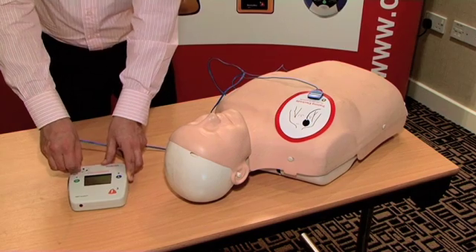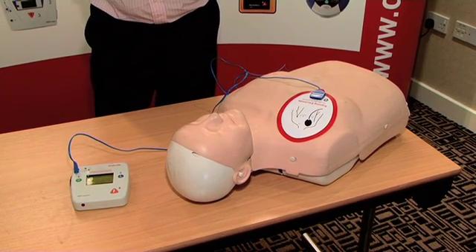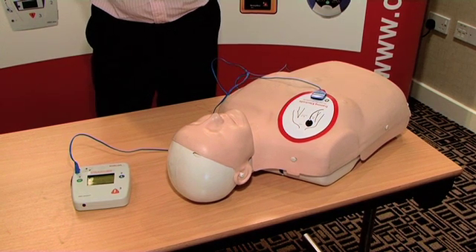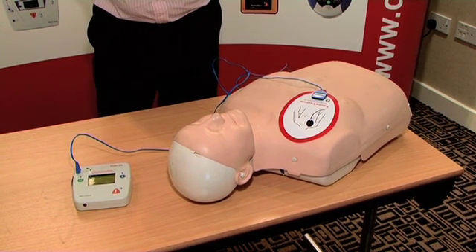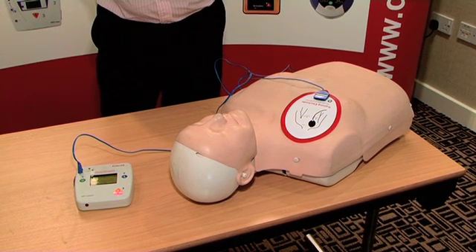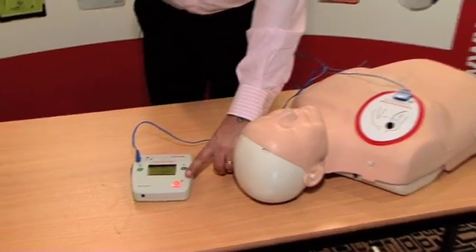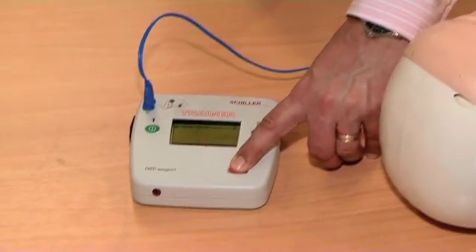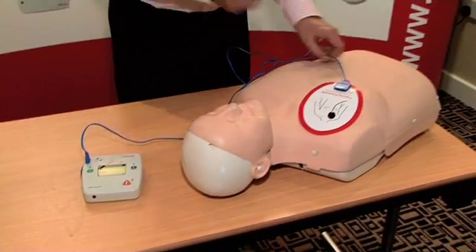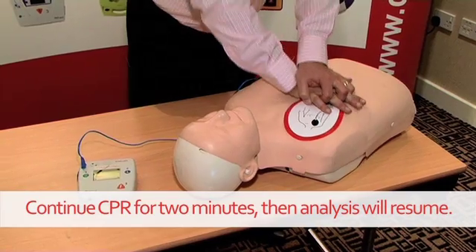Do not touch the patient — analyzing. Do not touch the patient — charging. Stand clear of patient, press orange button. Stand clear. Immediately resume CPR: 30 chest compressions, then 2 rescue breaths. Continue until patient is breathing normally.